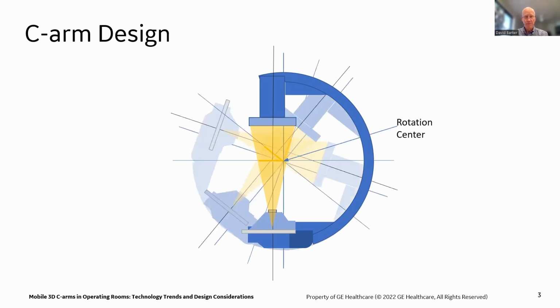The shape also comes from the fact that it's rotating about a center point, about an orbiting point. So it orbits about this imaginary point in space and can articulate around. And because the motion is more or less an orbiting motion, a lot of times this kind of rotation is called orbital rotation about that center point.